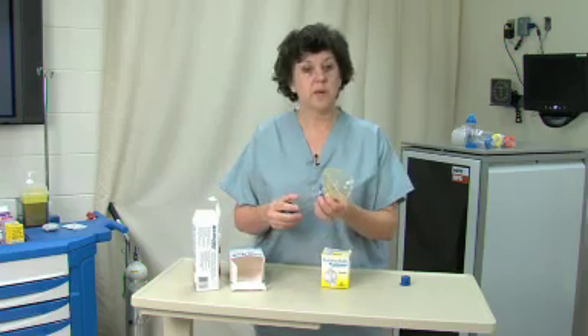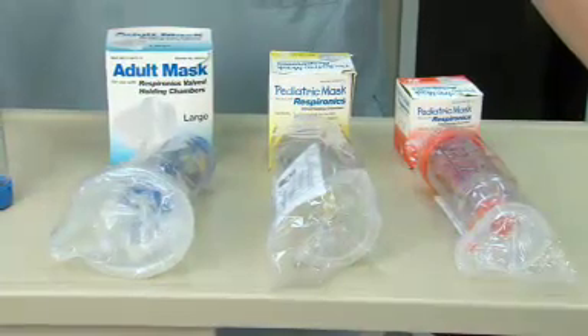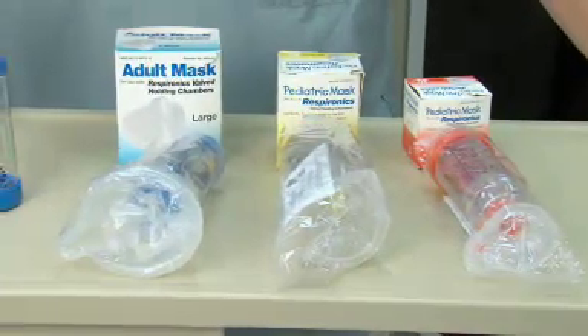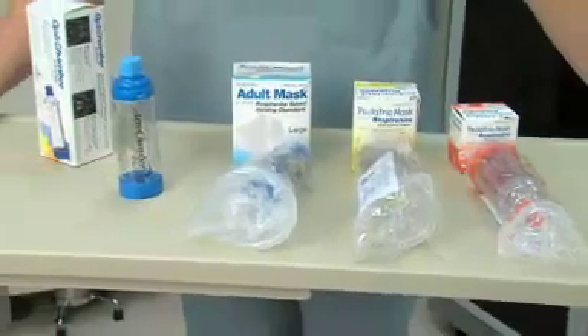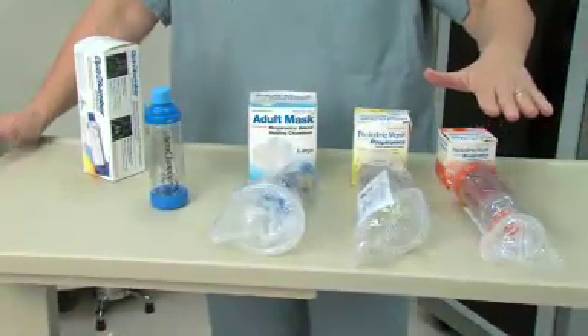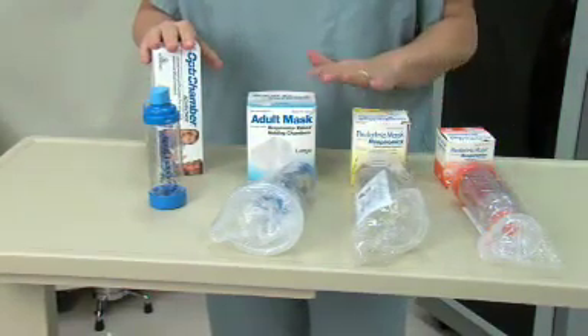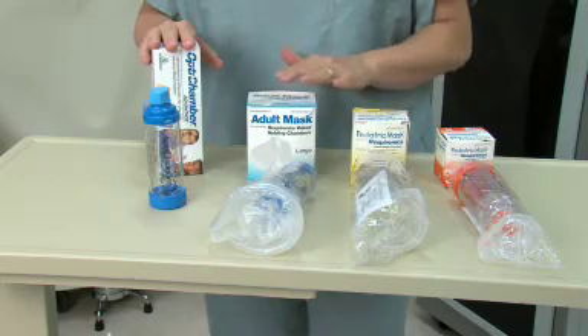And then we have an adult mask set up. So we can see there are a number of different ways that the manufacturers have chosen to design their products. We have the OptiChamber on the back side here with their individual masks — the neonatal, the pediatric, and the adult.